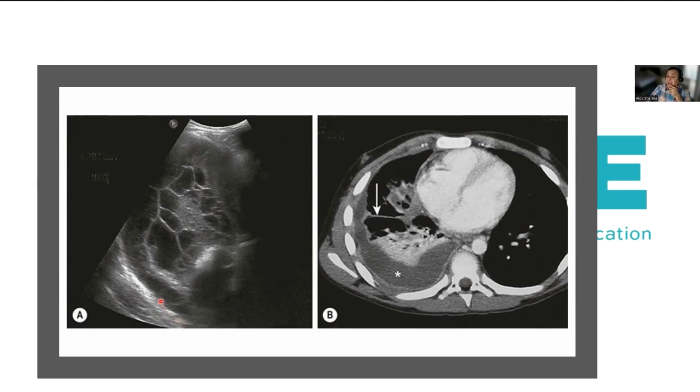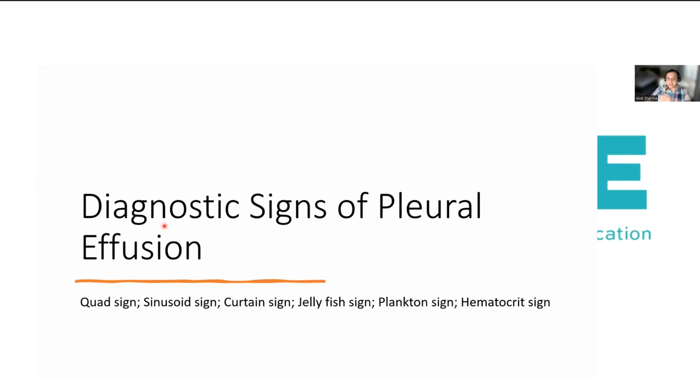You might actually agree that it's probably not the wisest thing to do. But previously, CT was the only way to evaluate this. And you can all agree that doing a CT would mean an element of transport if you do not have imaging in your neonatal unit, but more importantly, exposure to a large amount of radiation as compared to lung ultrasound, which can be done bedside quickly and in a very short period of time. So the benefits, I think, are very important.